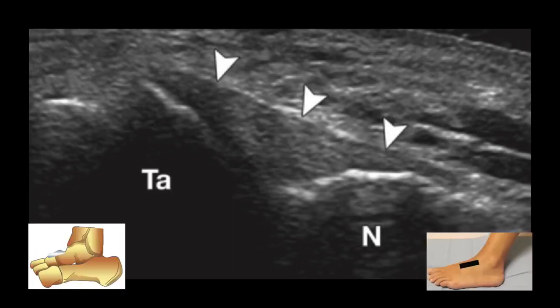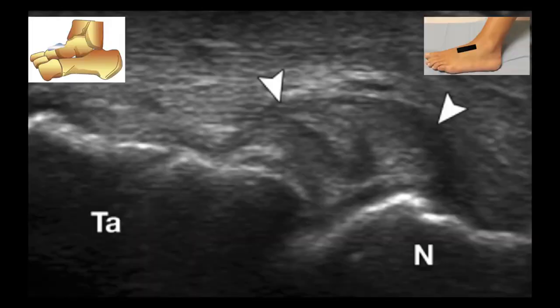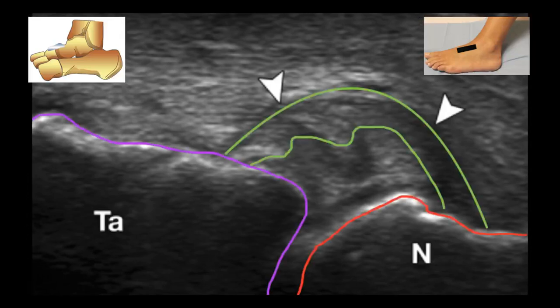Similarly to how we identified the dorsal calcaneocuboid ligament, for the dorsal talonavicular ligament, as long as the probe is placed in the proper position, as you can see here, the talus and the navicular will come into view, and you can see the normal fibrillar echogenic structure that runs connecting the two dorsally. The dorsal talonavicular ligament injury usually follows a plantar flexion inversion injury and can clinically mimic a lateral ligament complex injury. In this image, you can see the fibrotic, inhomogeneous nature of the ligament, and as opposed to its normal homogeneous fibrillar echogenic structure, it is now more hypoechoic.